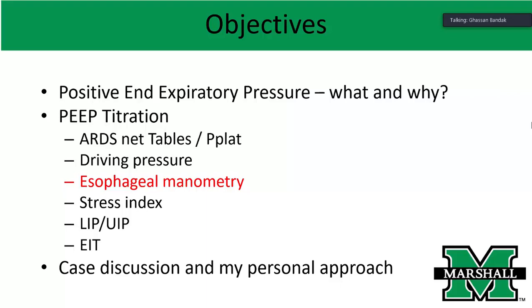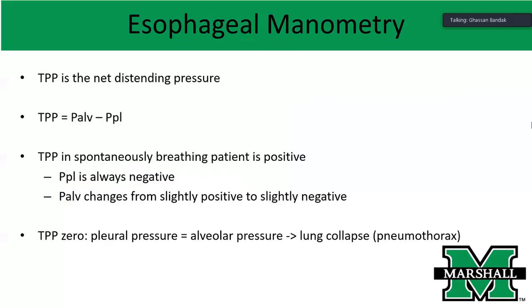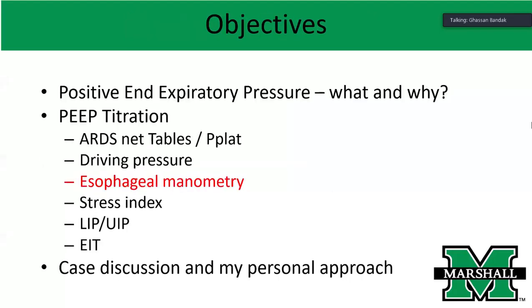Okay? And for the sake of time, let me just go through, because we have 11 minutes left. So let's talk about esophageal manometry. I just want to say that I agree with what Dr. Al-Jasmi said, that you have to be at the bedside and come back and reevaluate. If you make a change and want to give it time, don't give it 12 hours. You can give it a few hours, come back, reevaluate. So it's very important for you to be at the bedside frequently if you're doing adjustments and evaluating the effect.